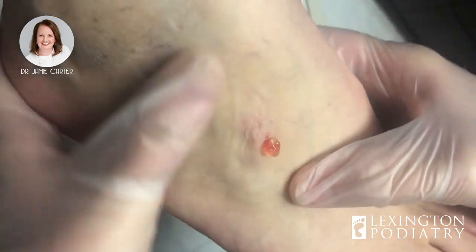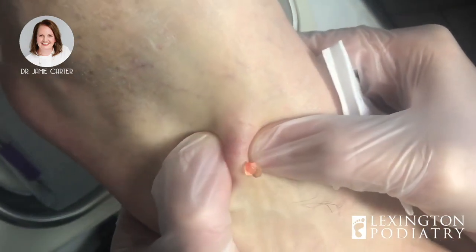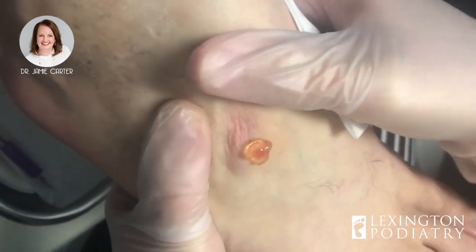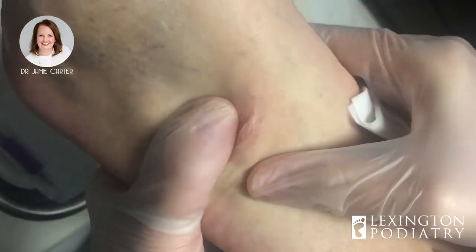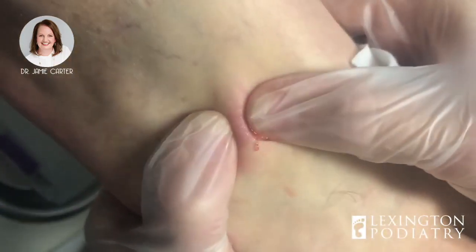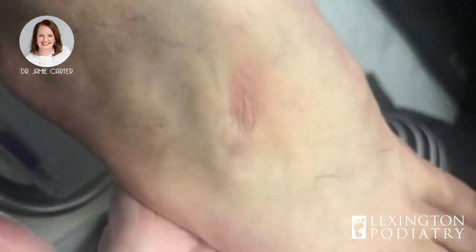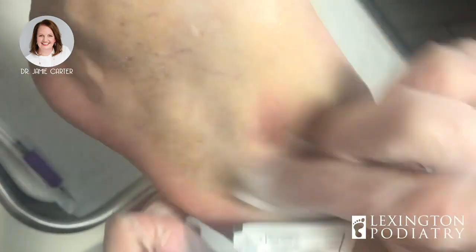We may not be able to get every single bit of this out, and that's okay — we're going to inject a little bit of steroid in there as well, and that will help to shrivel up the rest of the sac from the cyst. As he described to me, this thing has little tentacles that kind of go into all the little nooks and crannies of his foot, so that makes it pretty difficult to get every last piece. As I move my thumb over his skin, I can feel things moving in there.